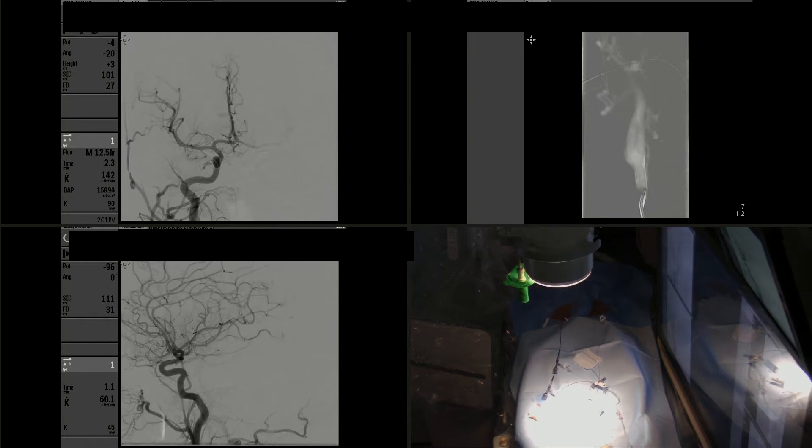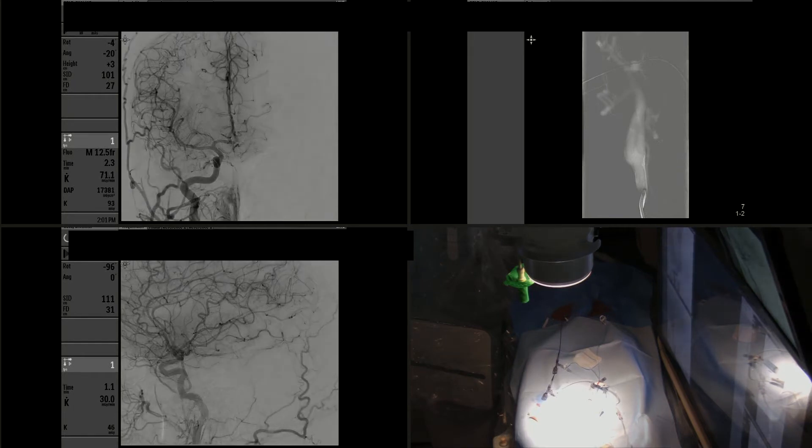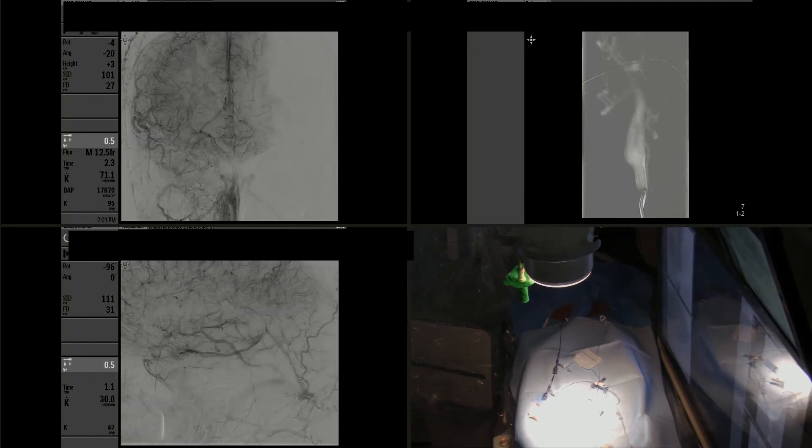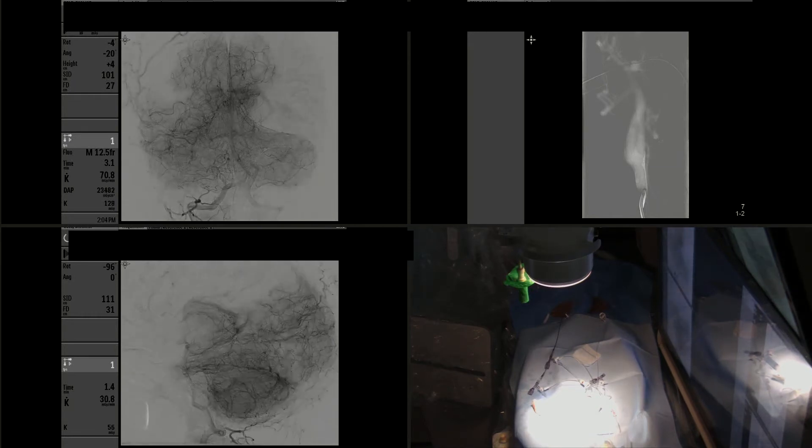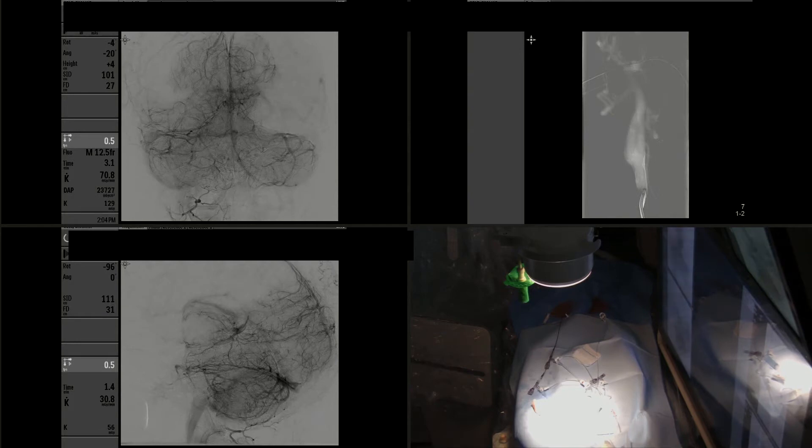As part of the workup, we did an angiogram of the external carotid artery that demonstrated there was no supply to the arteriovenous malformation. We did a contralateral carotid injection that did not show evidence of arteriovenous shunting, and we also checked the posterior circulation. As you can see, the right vertebral artery injection doesn't show any significant supply to the malformation.